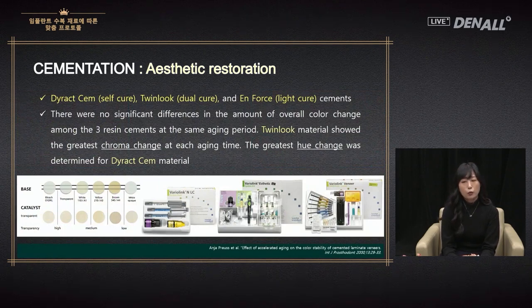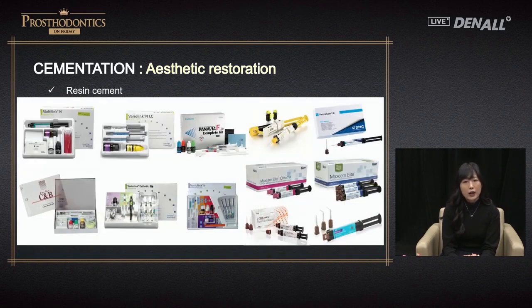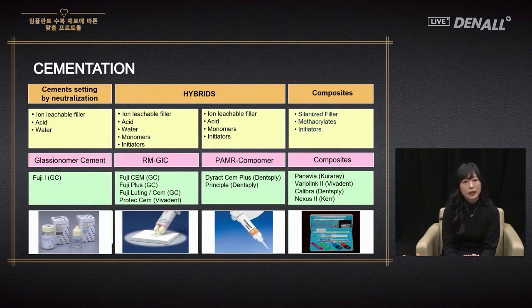As shown, cement, which is an essential element in aesthetic restoration, has different color and transparency, and in the case of restoration with high transparency, this is very important. Among these products, at times, curing can affect discoloration of the restoration, and there's a study on this. Light-curing cement shows the least amount of change. As restorative materials for dental purposes improve, various ceramic restorations, fabrication, and clinical application have become possible. The surface treatment method and cementation process for ceramic restoration have become more simplified.